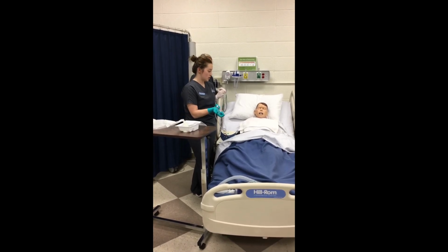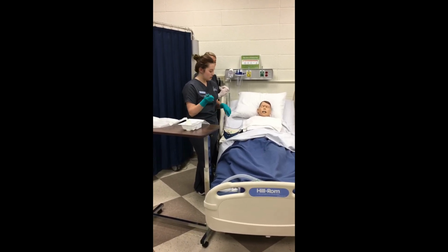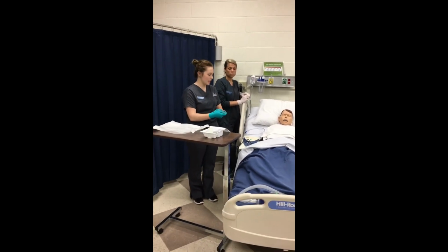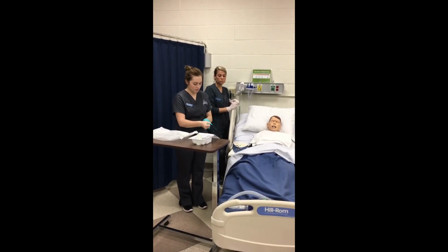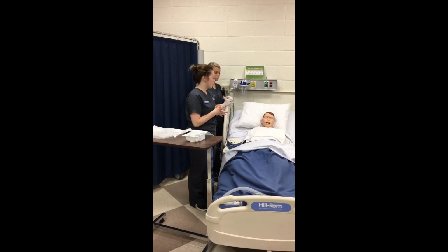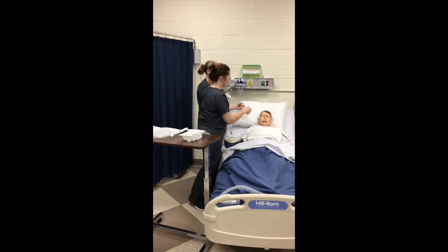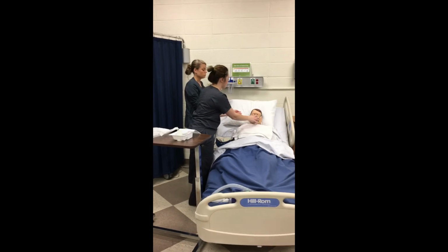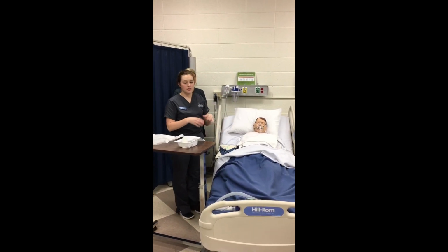My patient is currently in good standing and doesn't need any further suctioning, so I'm going to remove the suction catheter from my wall suction and discard it in my sterile gloves. And now I am going to reapply my oxygen and make sure that it is set back to pre-procedure settings.